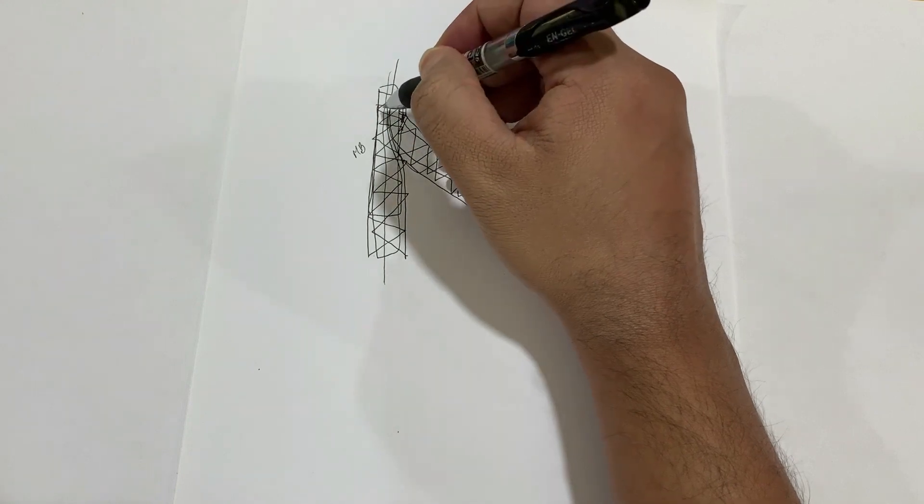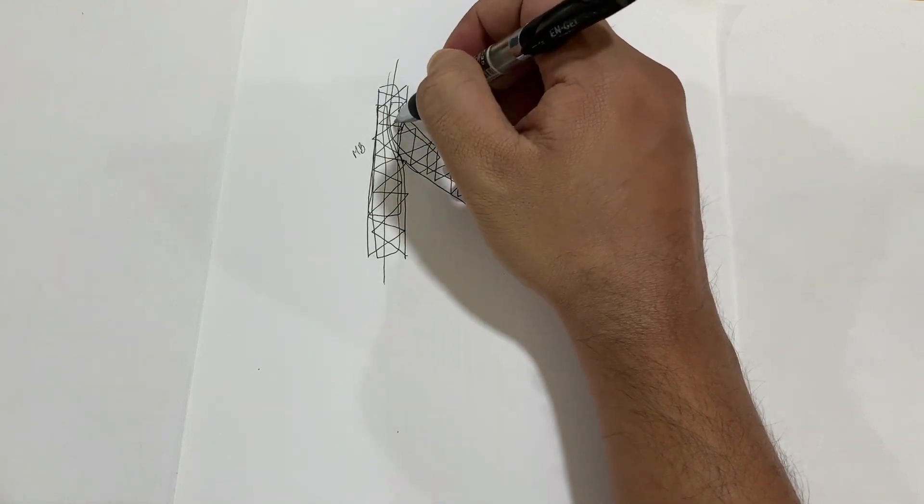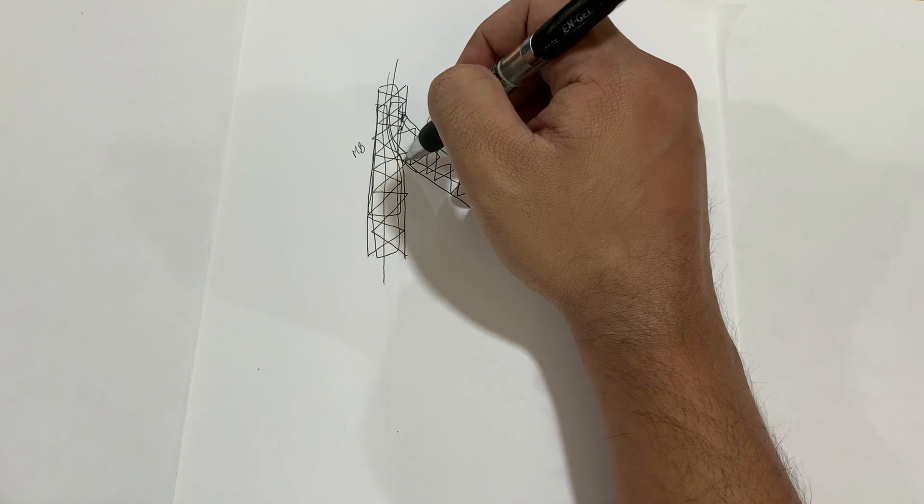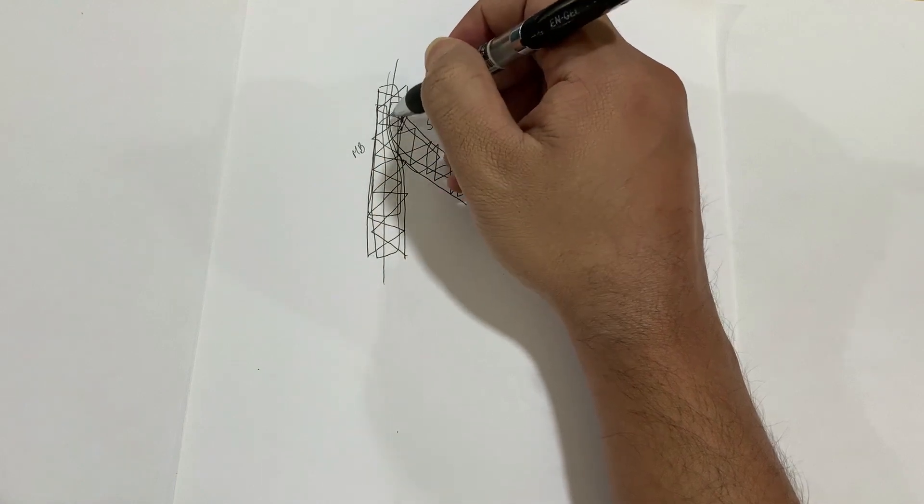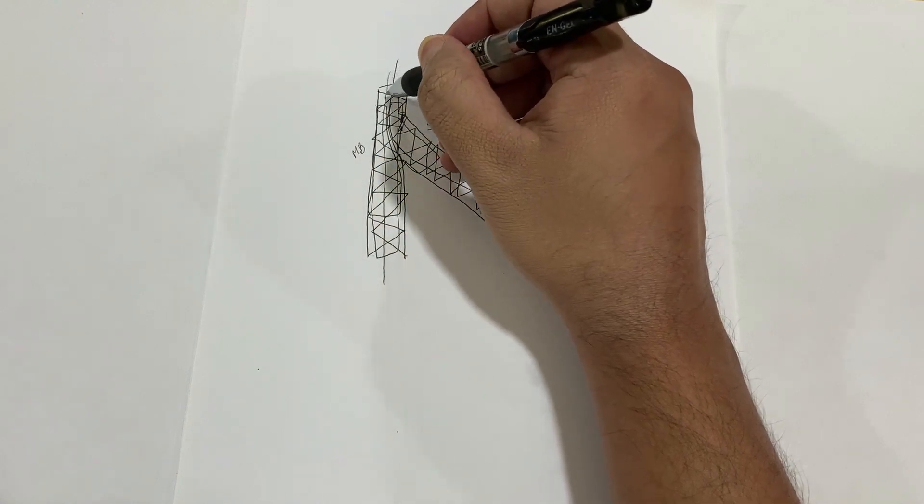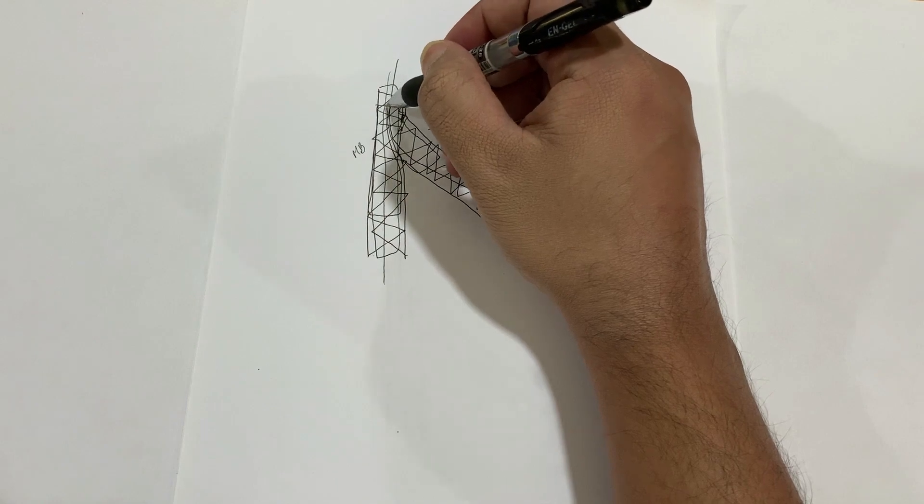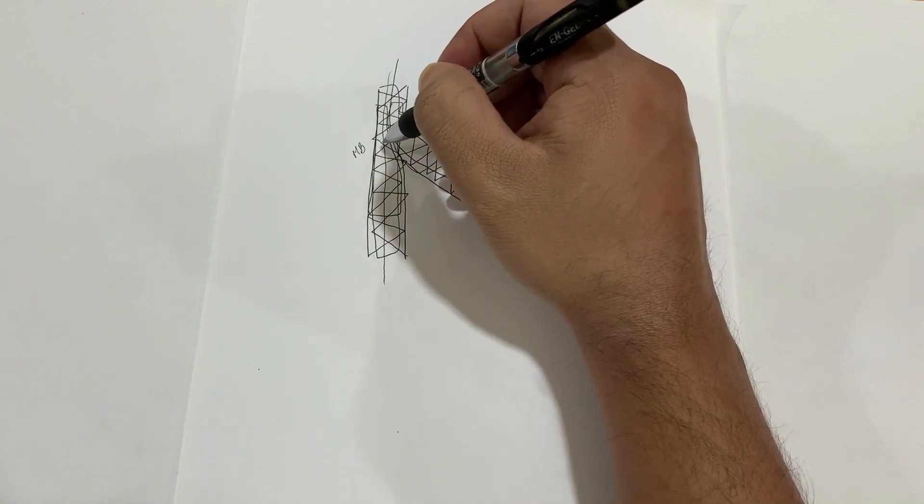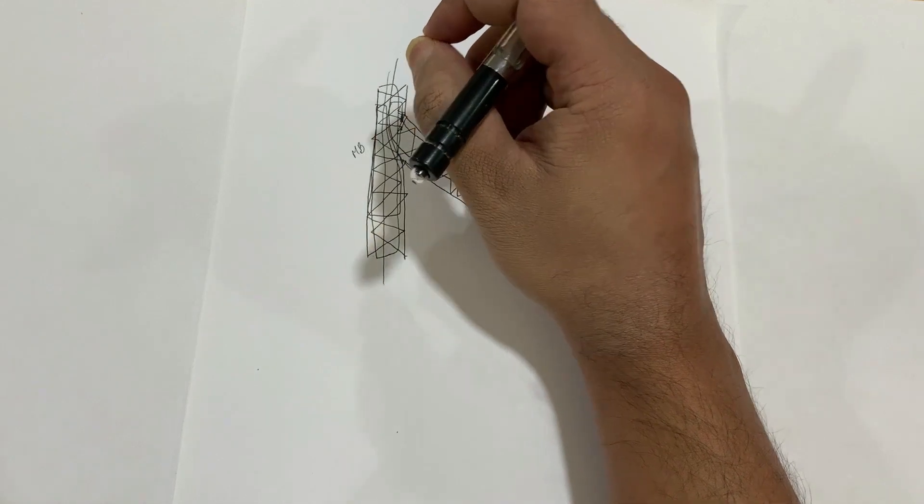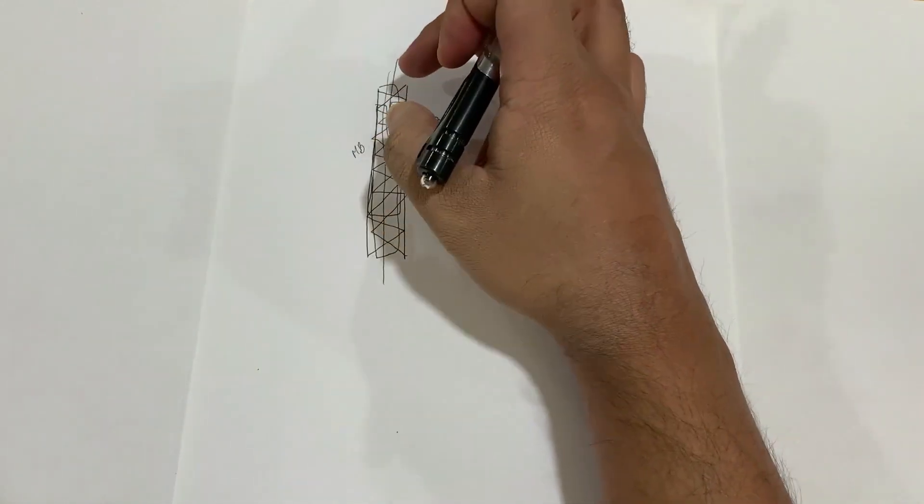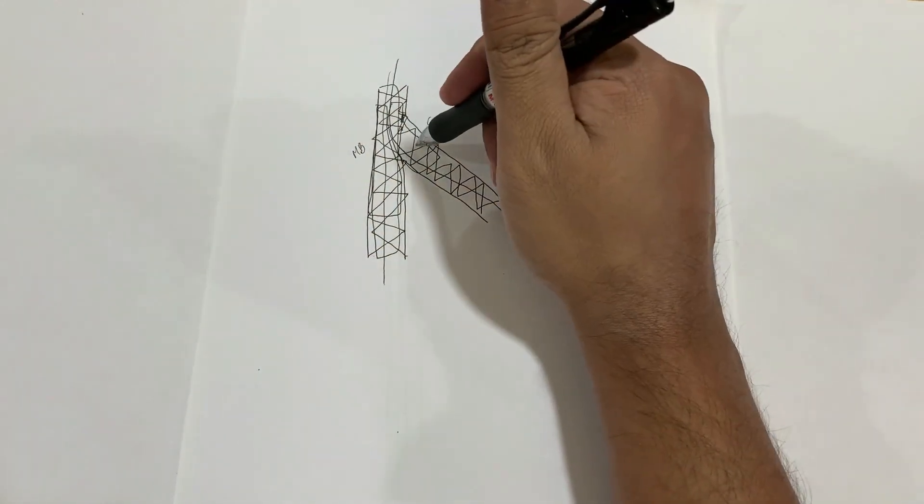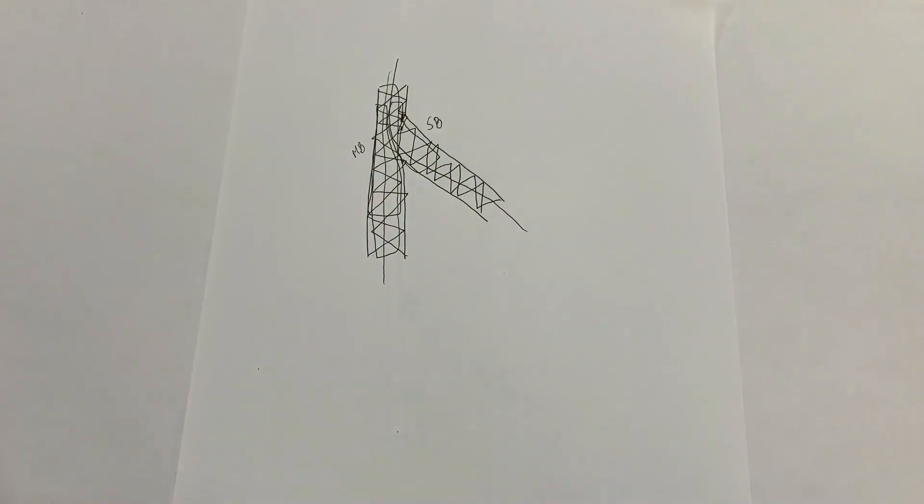The balloon should always be covering the whole stent area. If it is not covering it, there might be difficulty to advance the balloon or the stent across this small narrowed area. So it's very important to have the balloon or the stent present when you are inflating the side branch stent.